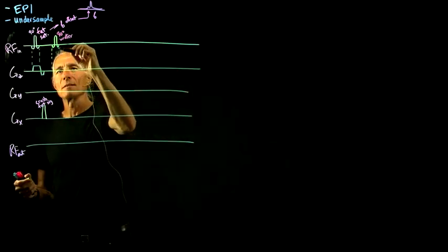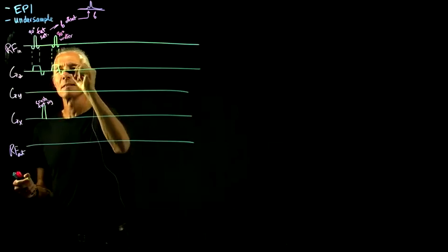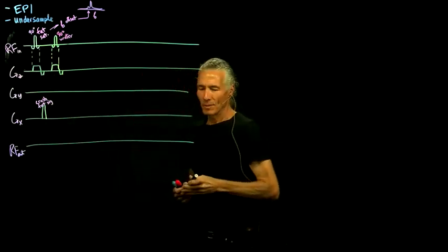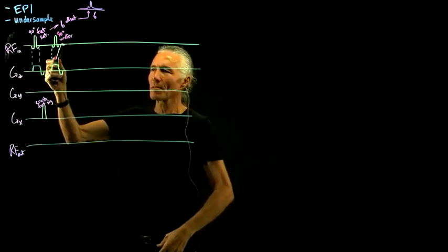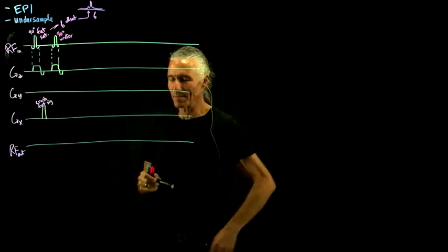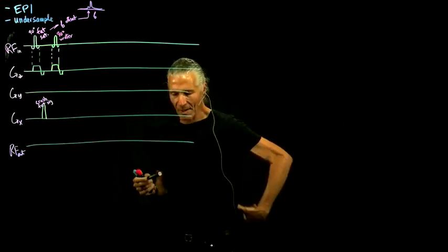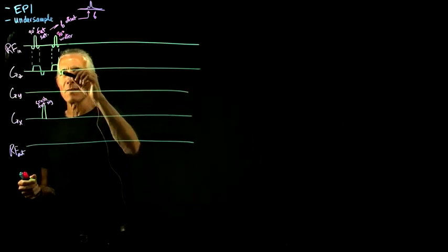So here's another slice select, and we'll now do the flip that's going to generate the signal that we're going to use for the whole rest of the sequence.